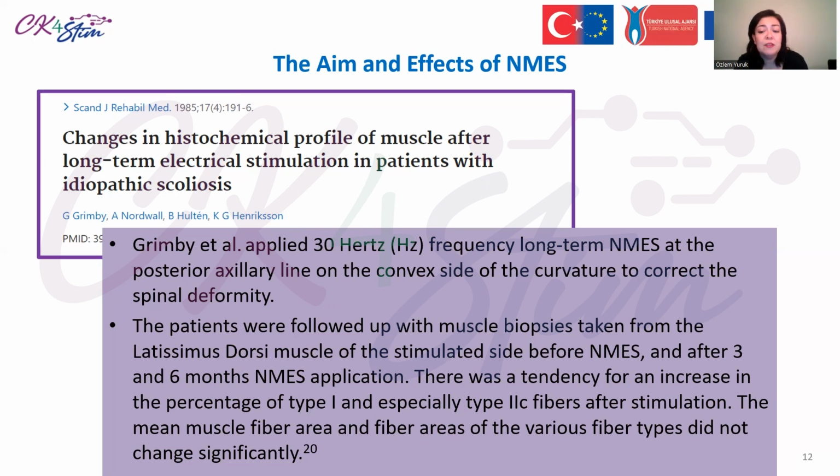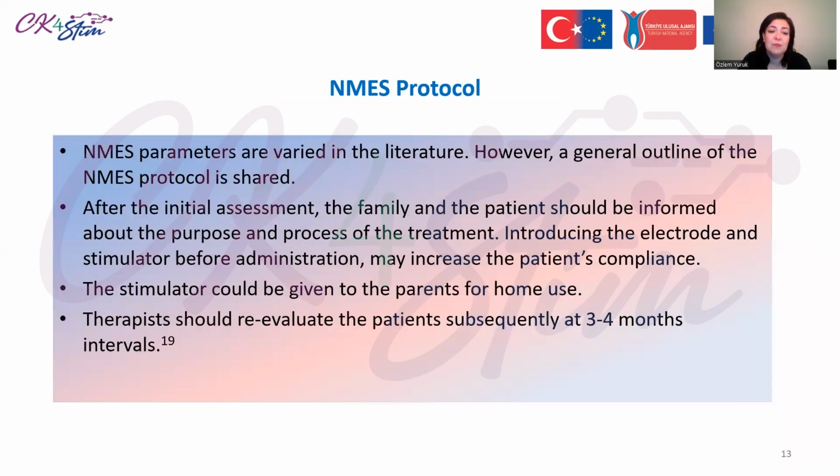In recent years, studies showing the effect of short-term, 1-hour electrical stimulation combined with other conservative methods have been published. Now the neuromuscular electrical stimulation protocol for scoliosis. Electrical stimulation parameters vary in the literature. However, a general outline of the electrical stimulation protocol is shared.